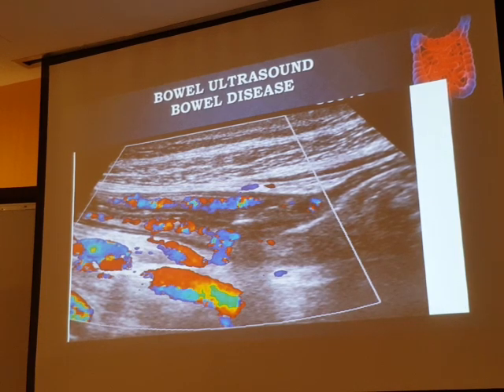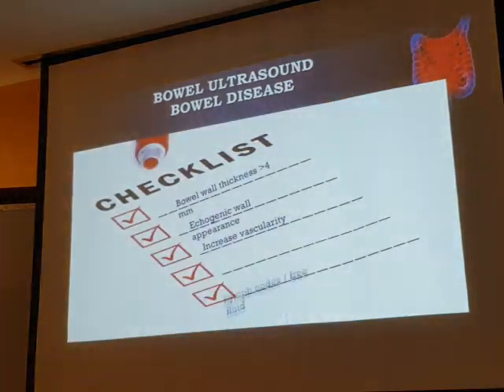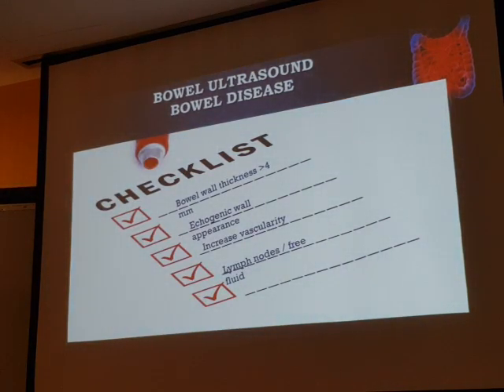What is it here in the lower? Iliac. Okay, this is the iliac vessel. Lymph node. While we are scanning, we have to look for what? Lymph node and free fluid. Once you see it, there is something wrong in the abdomen.